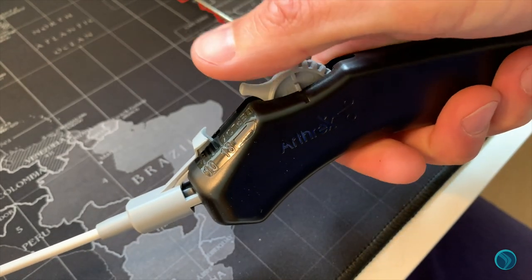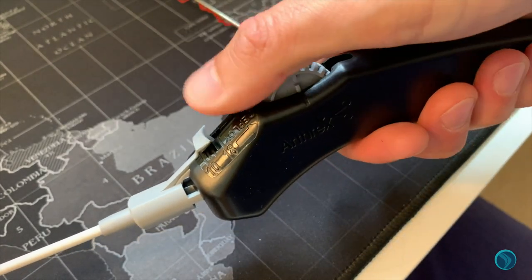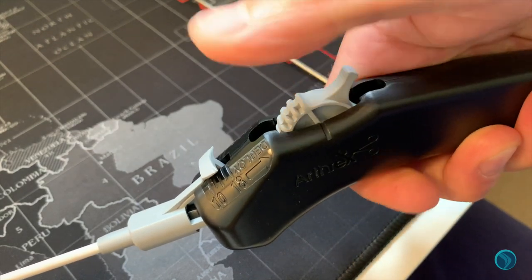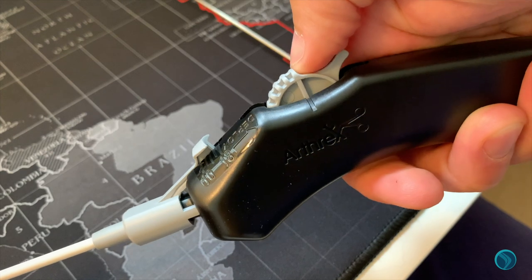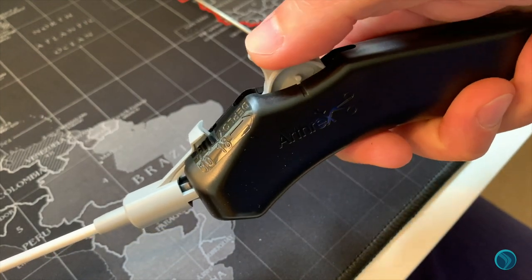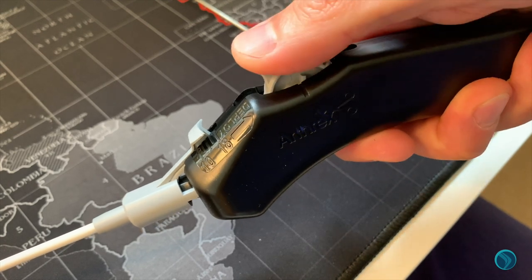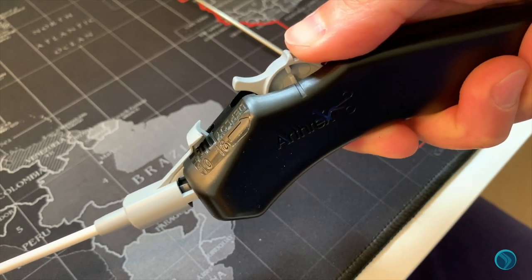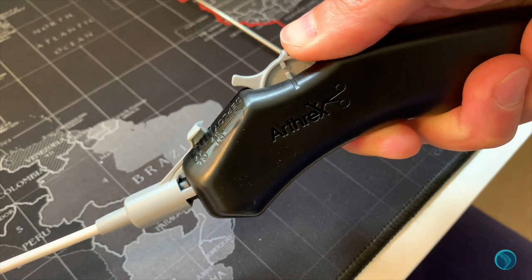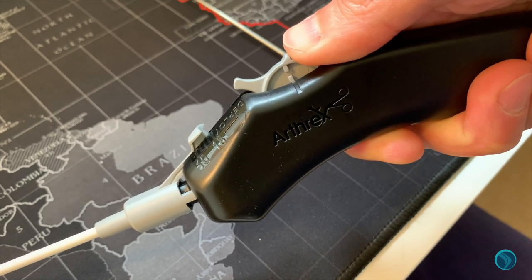Once again, repeat the process by rotating the wheel as far back as it will go until you get a stop and a physical click with a single bar, and then rotating forwards to deploy the second suture again with a physical click and a split bar to indicate that you have completely deployed the suture.